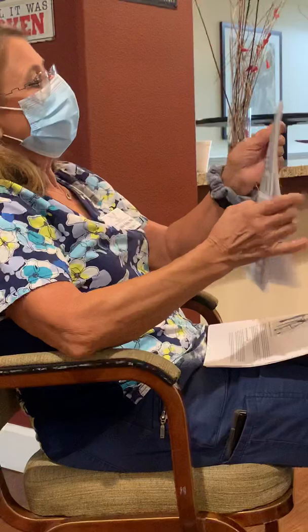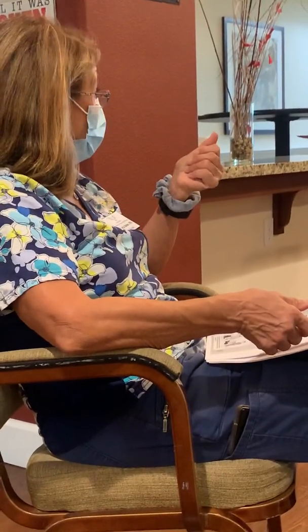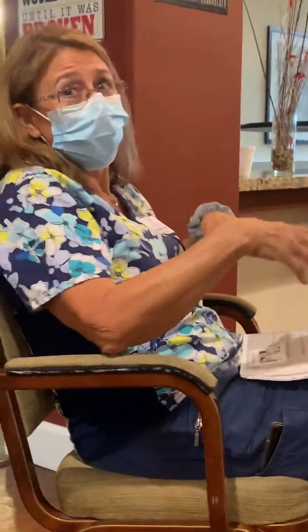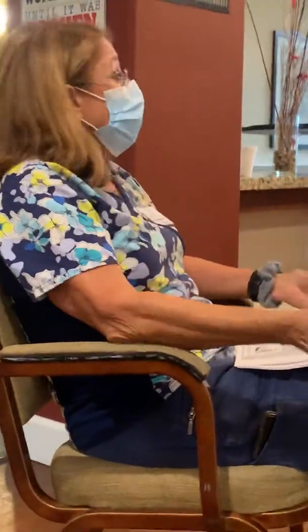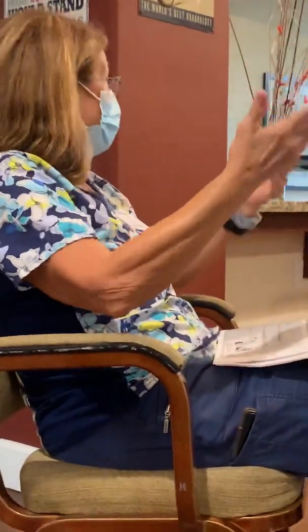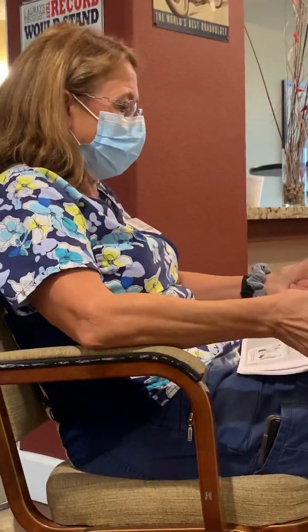So what you're gonna do is stabilize that catheter with your dominant hand. Okay, so get on that side of the bed too. Make it easy on yourself. Make sure you have all of your equipment there, everything that you need. Raise that bed up. Don't bend down. Get either him or her into a lithotomy position, which usually is up like this, the legs up like you would for a pelvic exam.